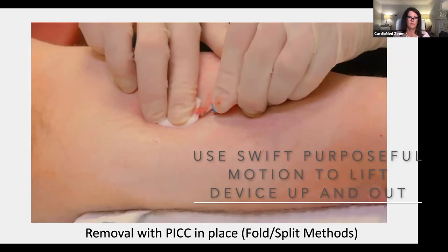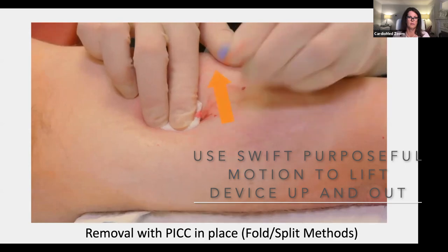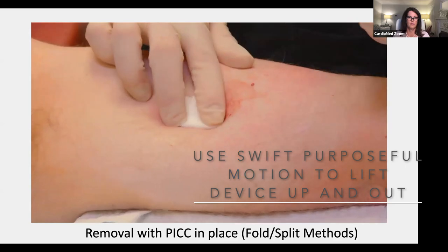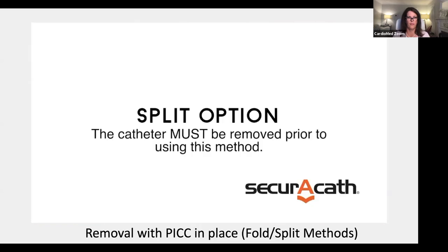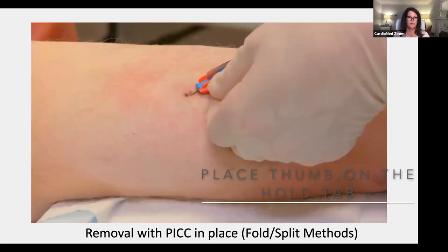Let's look at that again. You use a swift upward motion with a flick of the wrist to pull the SecurAcath out. The second method is the split or the cut option, which is not usually used unless you're having difficulty with the removal. Grip the hold tab on the SecurAcath with the thumb and finger of one hand to stabilize the device and securement feet beneath the skin.